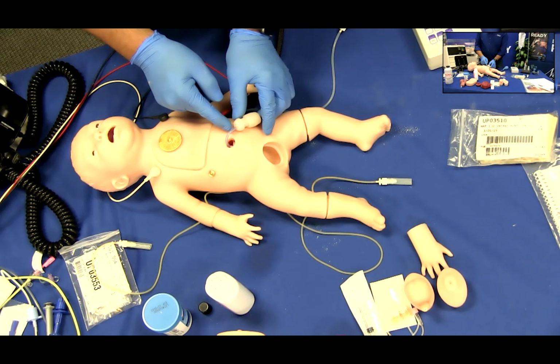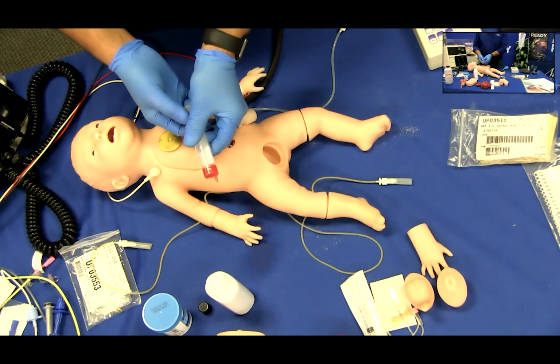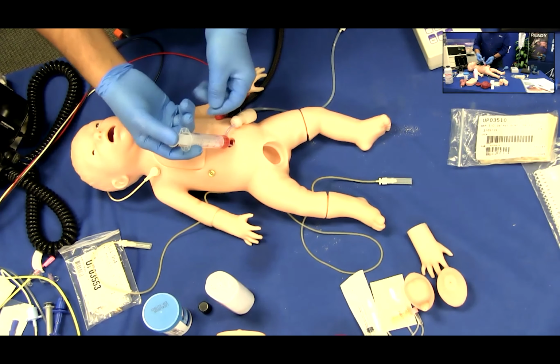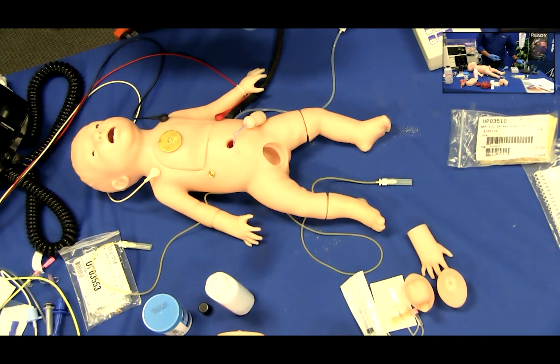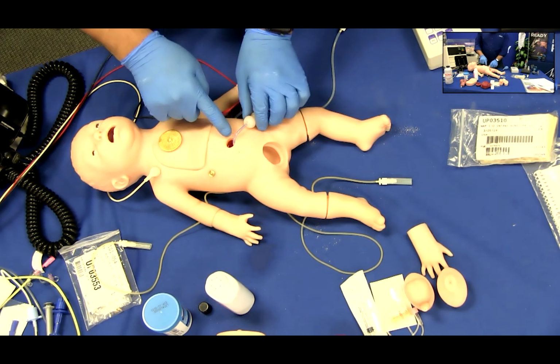Using the supplied syringe, depress no more than 5 milliliters of simulated blood or fluid into the abdomen. Replace the umbilical stump, being careful not to kink the tubing for the pulse system.